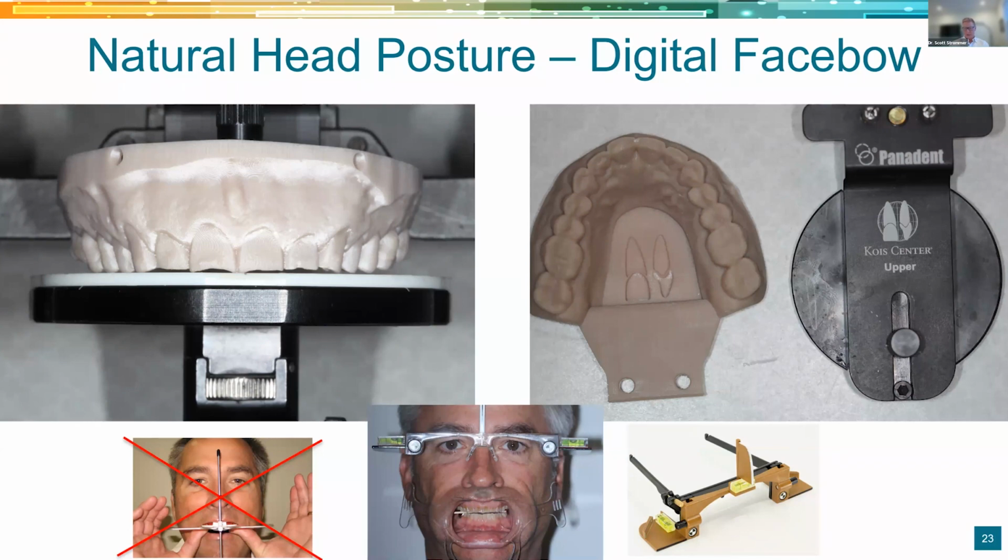These are all the little, subtle things that, in my system, I don't have to think about anymore. But if you don't have a system, you've done your mock-up, and it comes off a little bit off, and then you're spending all this time either redoing it, trying to add in the mouth, or recontour in the mouth, or both. I'm pointing fingers at my lab, they're blaming me, saying this is the data you gave me. This is a way to avoid all that and be able to do these predictably from the beginning.